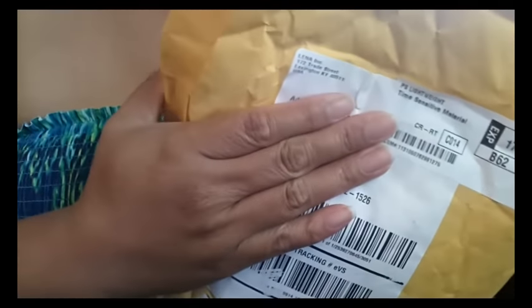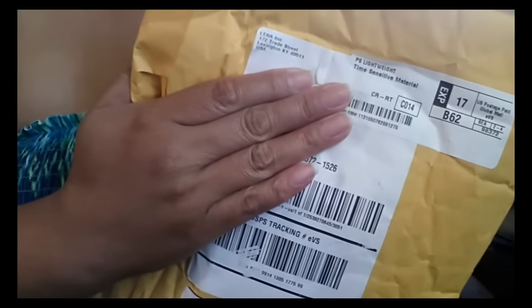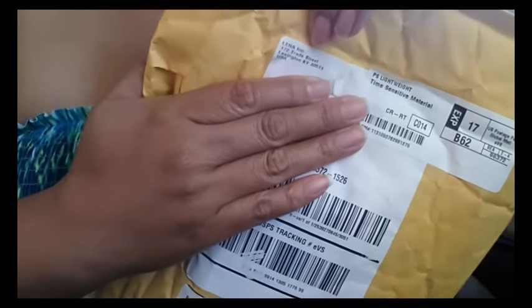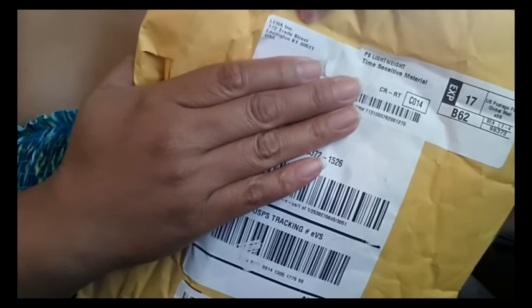I just did a video on the Super Jenny cup and here is the Lena cup that I just received. Both of the cups are made in the USA and they are both made in California, but this one shows that it was shipped out of Kentucky.